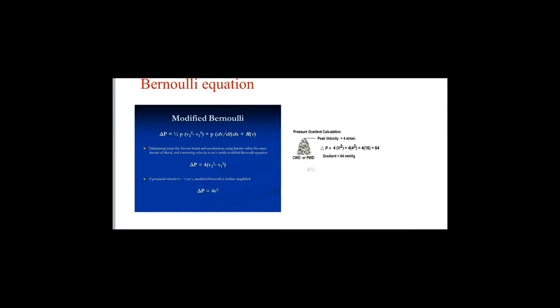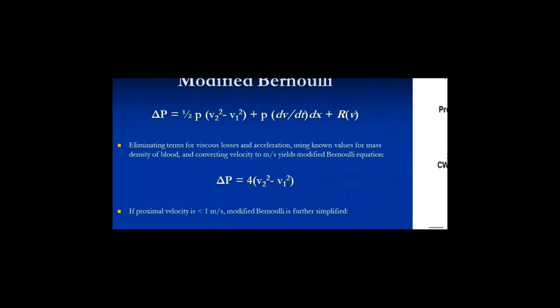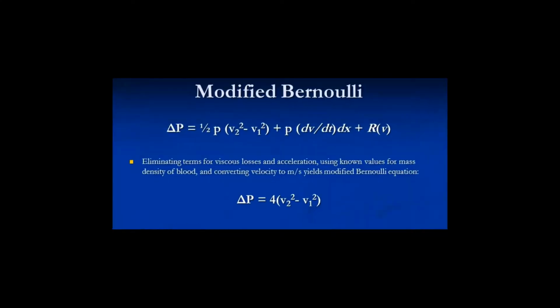Okay. Do you know this big equation, the one on top? I wish you don't. Very good. Exactly. Bernoulli is a physicist who came up with this equation a long time ago, and it was actually pertinent to the physics of fluids. It had nothing to do with echo at that time. It's basically the study of fluids and the dynamics of fluids within a closed system. Okay, but they have used it in echo because they assume that the heart is a closed system and blood is a fluid. But they cannot use this long formula.